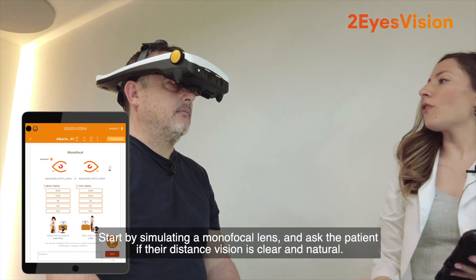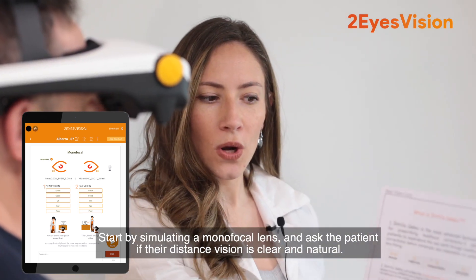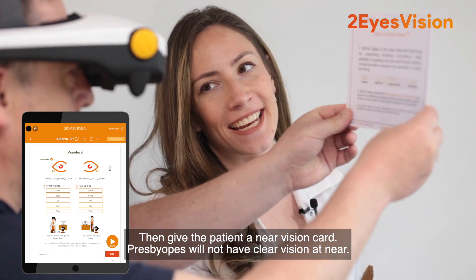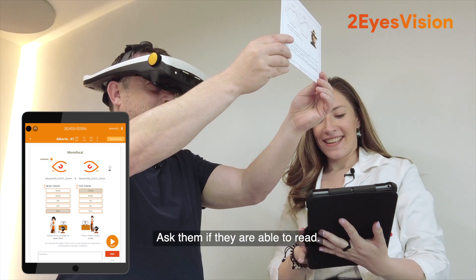Start by simulating a monofocal lens and ask the patient if their distance vision is clear and natural. Then give the patient a near vision card. Presbyopes will not have clear vision at near. Ask them if they are able to read.